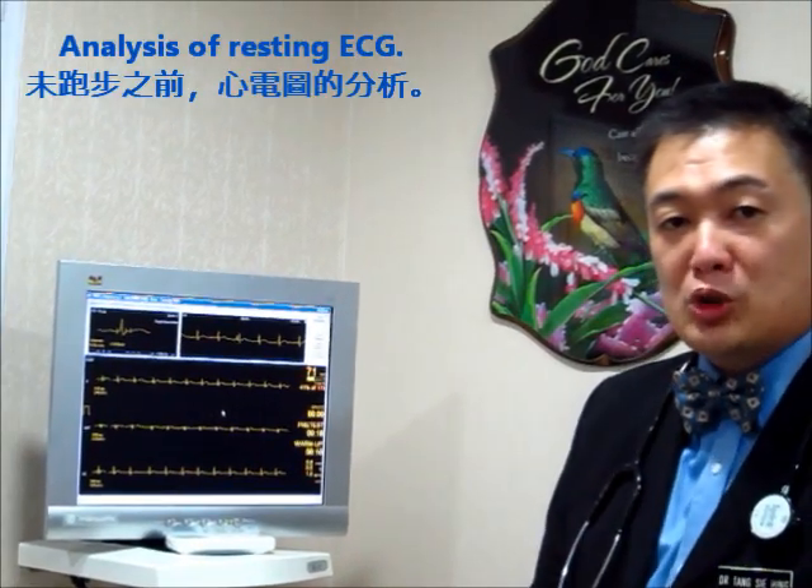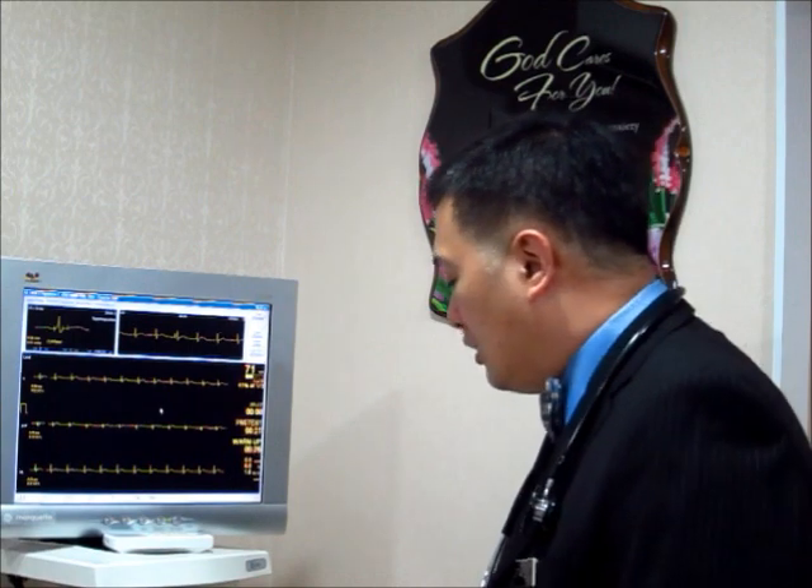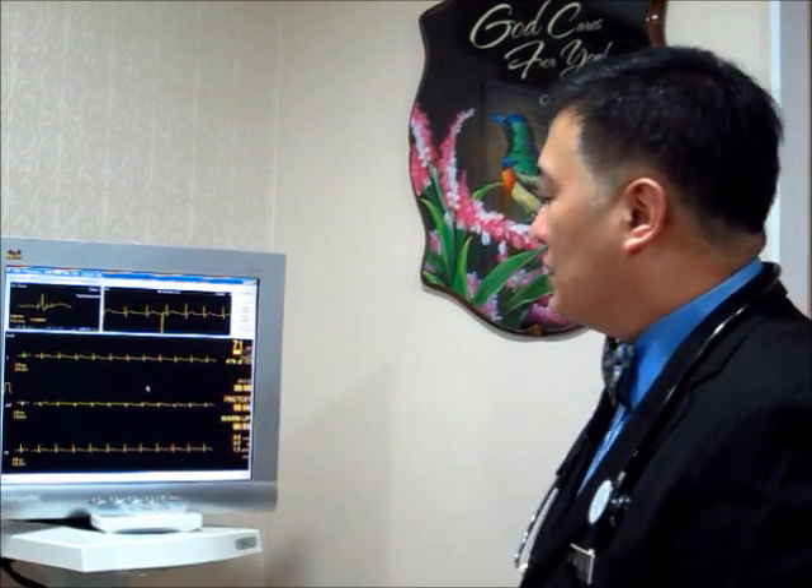Before we put the patient on the treadmill, we do a baseline ECG. It is important to check whether there are any pre-existing abnormalities. If the ECG already shows signs of a heart attack, it is probably pointless — and very dangerous — to stress the patient on the treadmill. In this case you can see the heart rate is beating at 71 beats per minute.